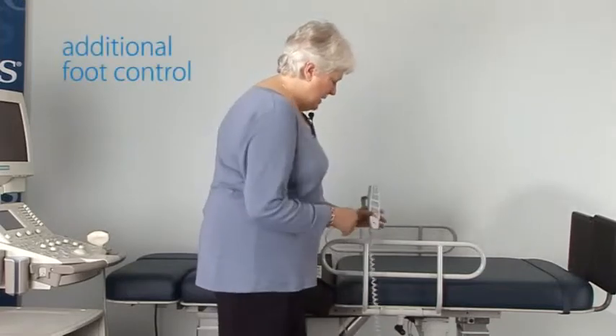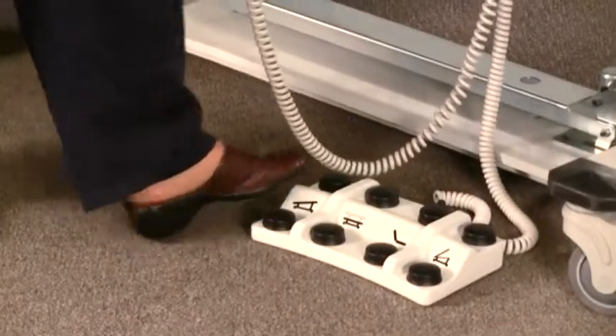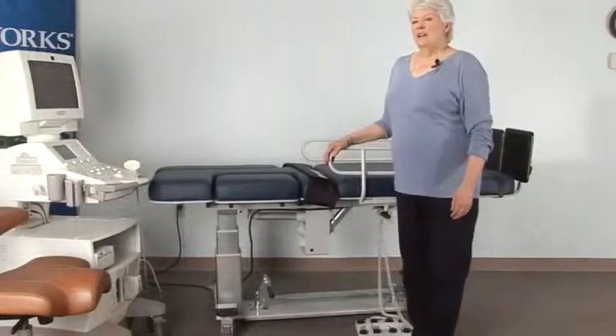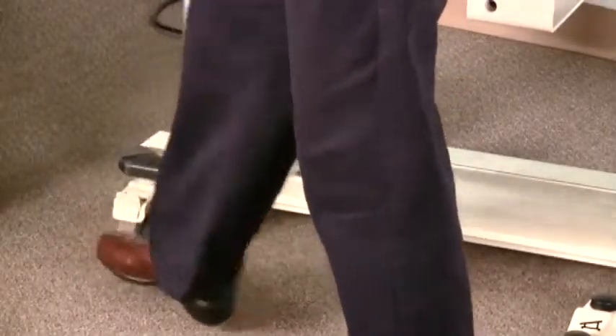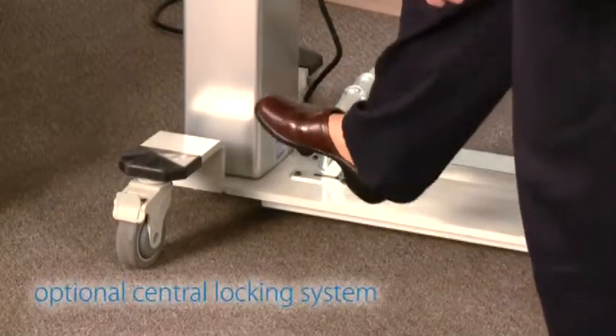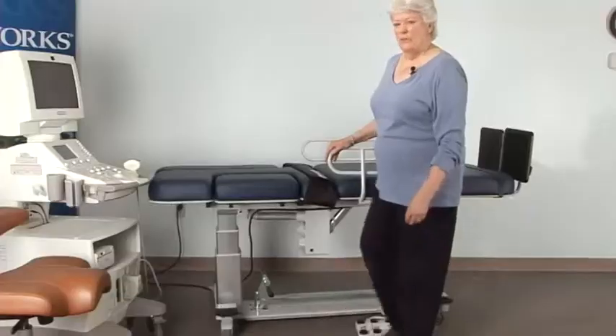In addition, the tables also have the capability of being controlled with a foot control. All of the exam tables come with individual locking casters. Some of the exam tables have the option of adding a central locking caster where all four wheels can be locked with one device.